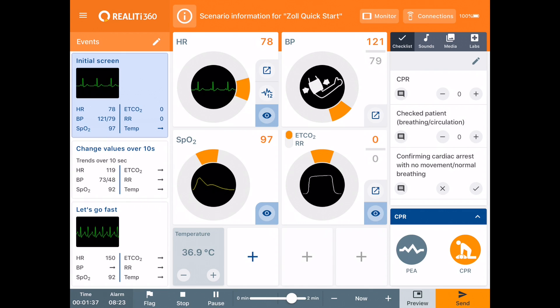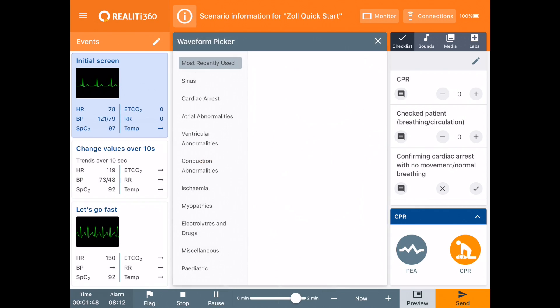I'm going to show you how you select a 12-lead ECG in Reality360. What you do is you simply tap on the waveform picker, which is the central part of the heart rate dial, and you can see the waveform picker comes up.